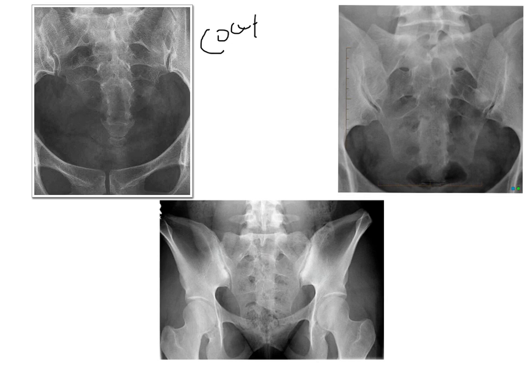Our right-hand corner, I'm going to put an S. This is for our AP axial sacrum. And the projection at the lower portion of your screen is going to be the AP axial SI joints. The best way to study these AP axial projections, just like we're doing here today, is putting them all out in front of you and really getting to understand and know the differences, because they all look somewhat similar. So putting them together and comparing the differences allows you to work your way through the process of eliminating which projection it is or is not.